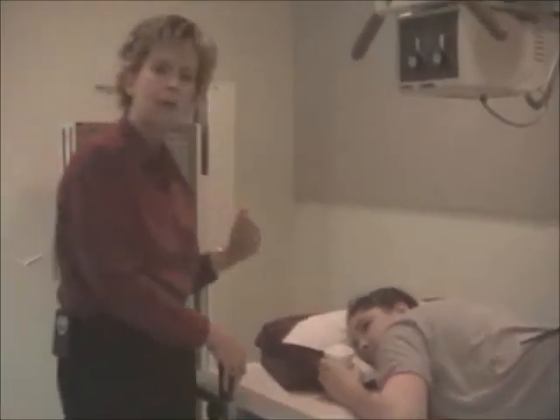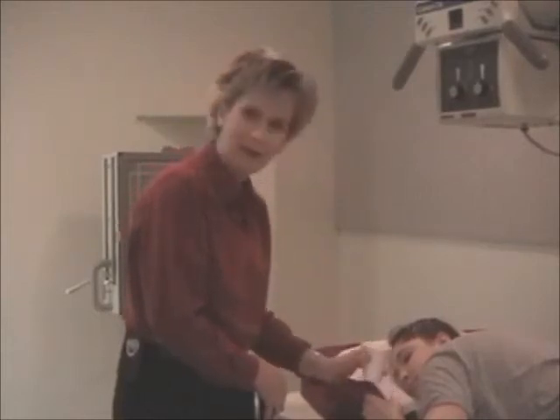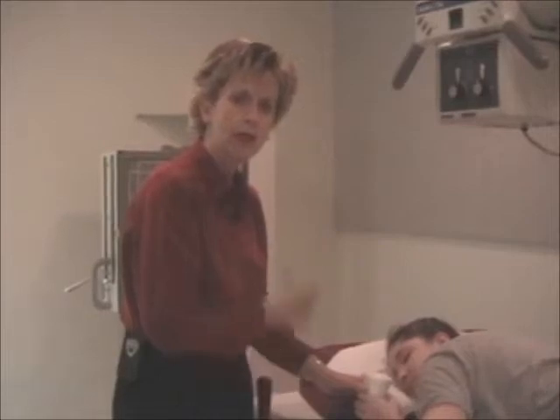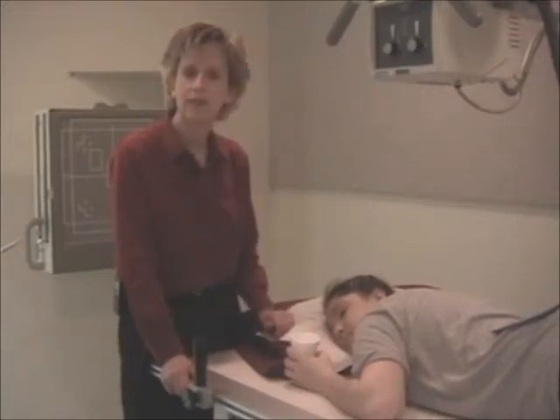Again, the film's edge will be level with the mouth. The trick here is to gain your patient's cooperation. Explain to them that it's going to be necessary for us to swallow the barium that's in the cup, for them to keep drinking, and to try to take big mouthfuls and take big swallows in order to catch the barium in the esophageal tract. And we're choosing to do the patient in a recumbent position because gravity will assist us in it.